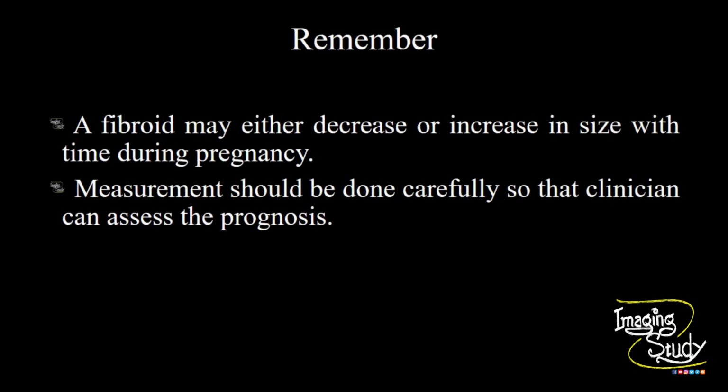Now the take-home message. A fibroid may either decrease or increase in size with time during pregnancy. Measurement of fibroid should be done carefully so that the clinician can assess the prognosis of the fetus due to fibroid.